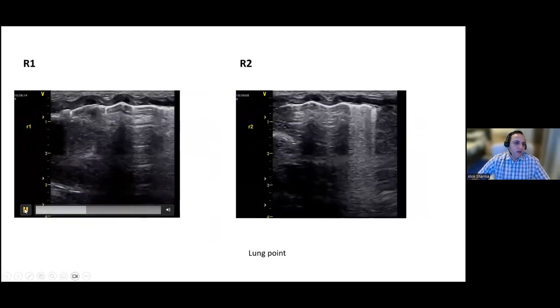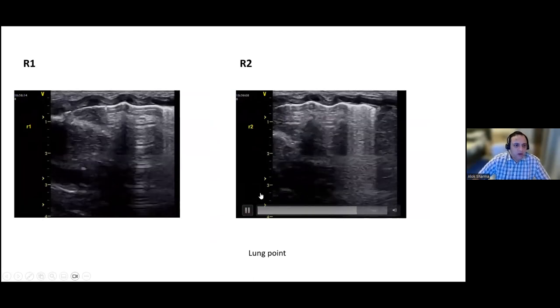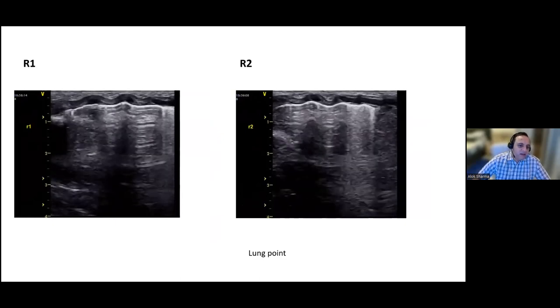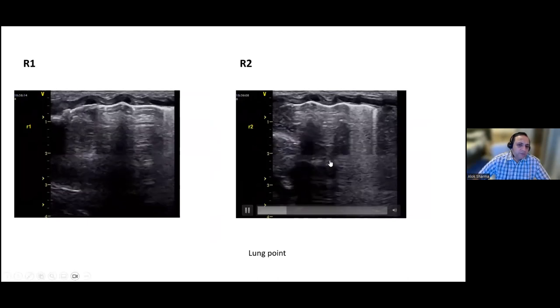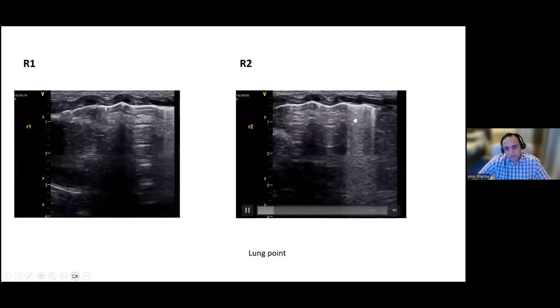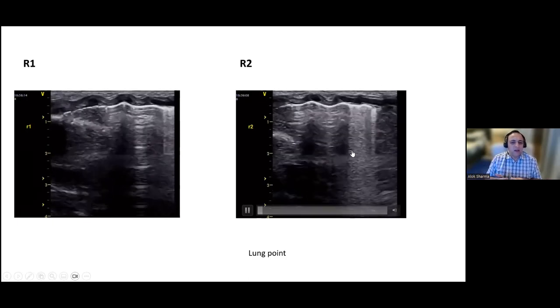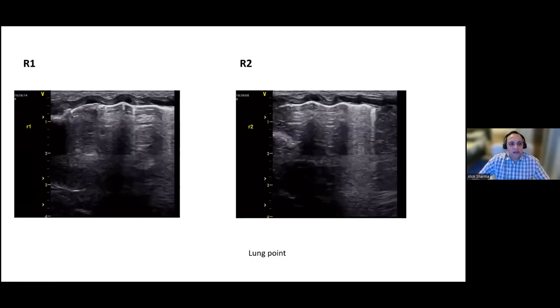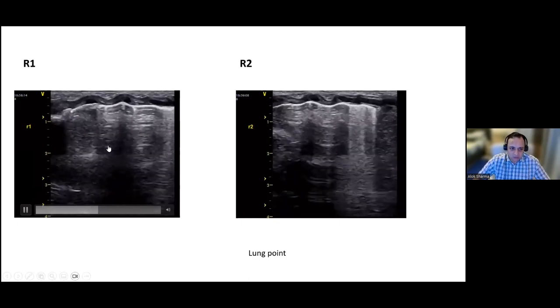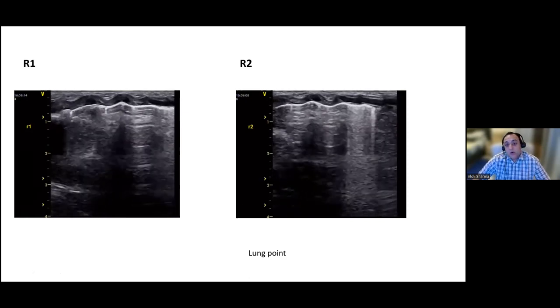Beautiful. Yeah. So really classically, the difference between a double lung point and spared areas is that, like here, you can see well aerated lung in R1 right in the center. So Naz, if you could just put your cursor over it. Yep. And really what you've got is a B profile with B lines right at the bottom of the screen. So what it reflects is a transition of aerated lung. Anterior areas tend to aerate first with a double lung point. Now, if you've basically got multiple areas, R1, which show B lines on both sides with an intermittent area of aeration, so you've got a B profile on both sides, then the area in between of aeration is called a spared area.